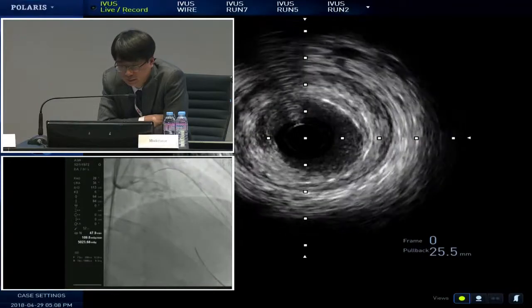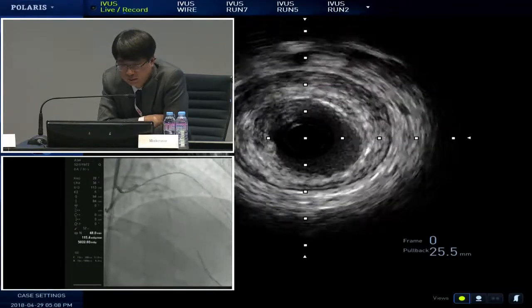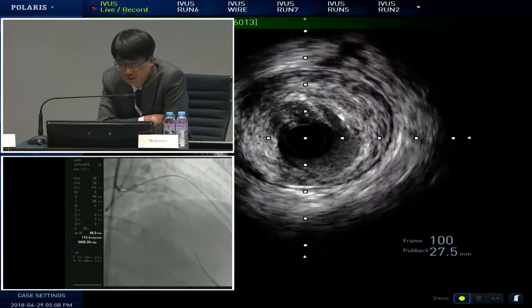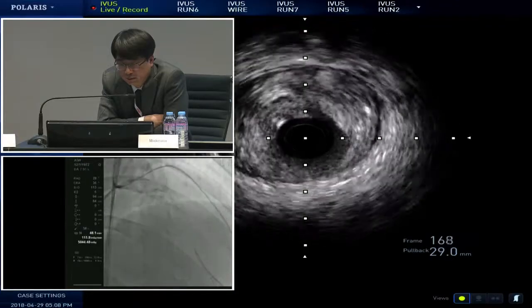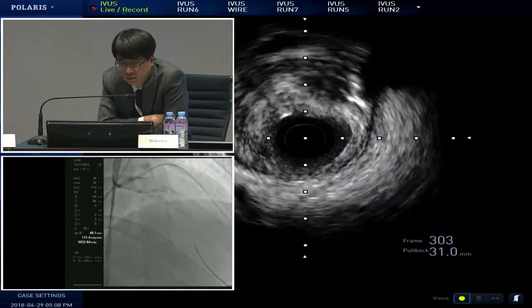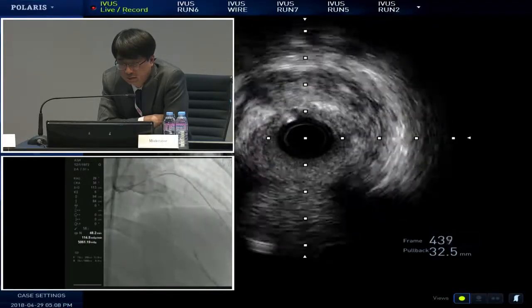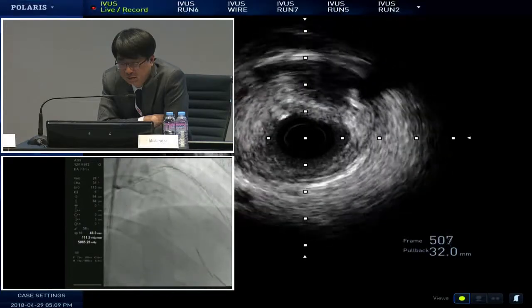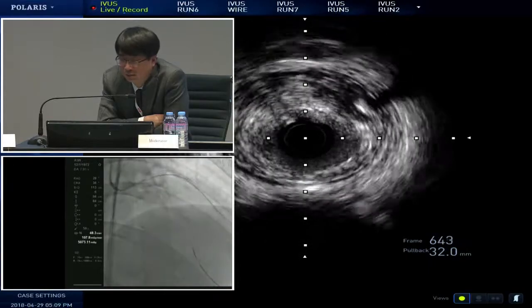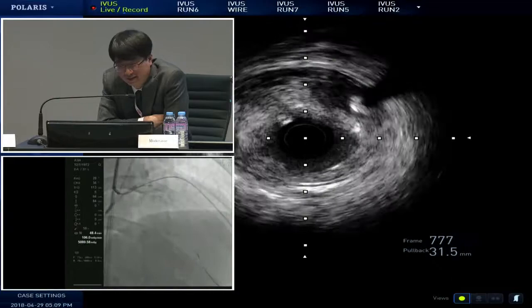Okay, this is the cutting balloon treated part. Intimal tear is detected at the 9 to 10 o'clock direction. Maybe correct. Okay, big plaque burden. If this were in Japan, I would try DCA. Very good indication. And the vessel size is big enough.